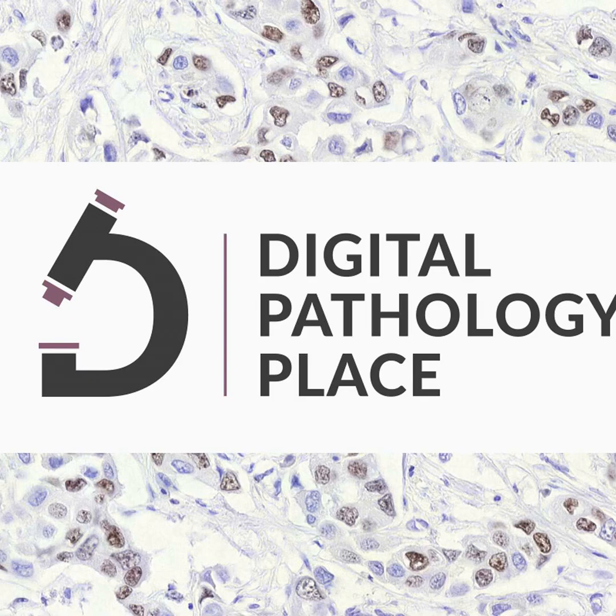It comes down to what's called overfitting. So if your model sees a set of patients, it can learn properties of the images in those particular patients. And so if you give it another image from one of those patients, it will probably do better on that image than on images from patients it hasn't seen. And the same would be true of different scanners if the colors have changed, or there might be something unique to a particular medical center. Maybe the pattern of artifacts in your image is different from one medical center than another. And so the model might pick up on that and learn something about the medical center instead of about what's in the patient's image. See, I didn't know that.